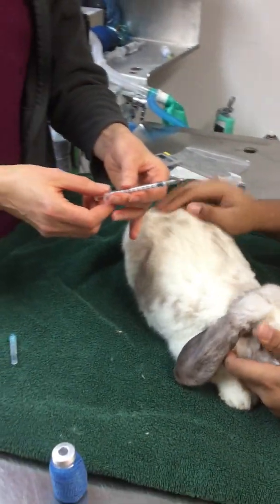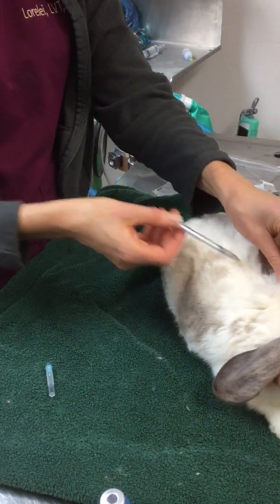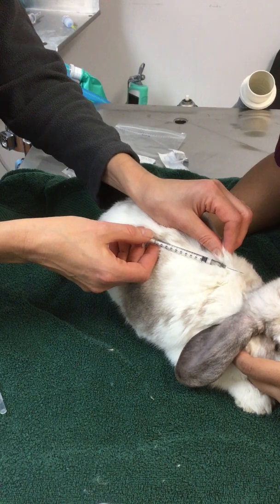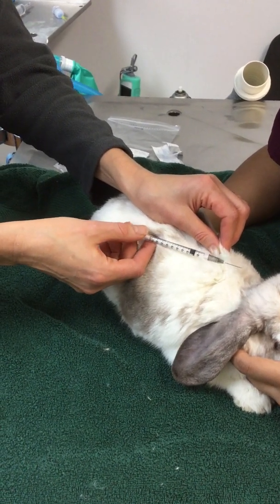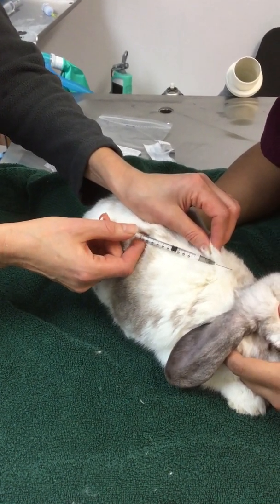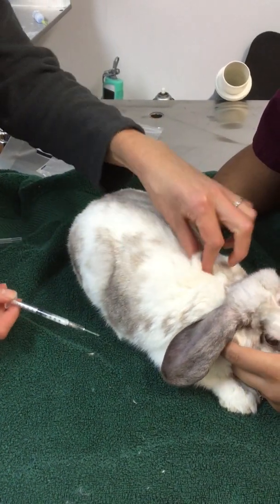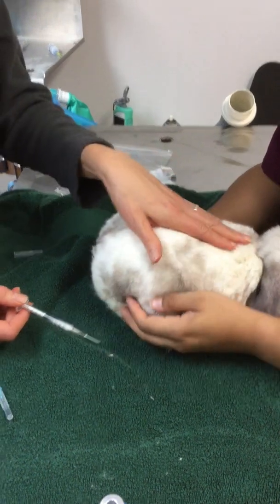What I was talking about was: say I had gone through the skin and come out the other side, but maybe I couldn't see it because of the fur. When I went to draw back, it would stay put. I'm drawing back — I'm getting air. See how it doesn't bounce back? That's how you know if you're actually in the right spot under the skin.